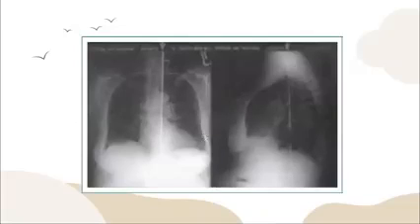Okay, pixel dropout or column dropout or line dropout, such as this one, in which an entire line of pixel is deleted. Interpolation can also be used to remove this artifact. So, in order to remedy this one, pwede siya computer algorithm na what we call interpolation. Okay? Interpolation is a process of assigning a value to a dead pixel based on the recorded values of adjacent pixels.